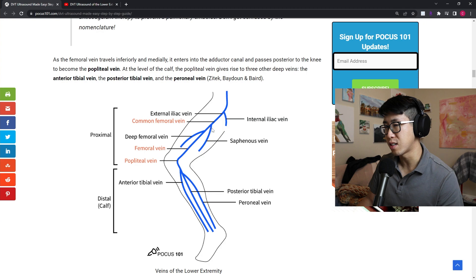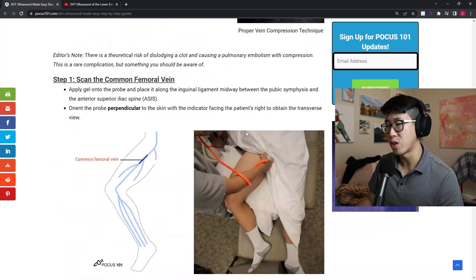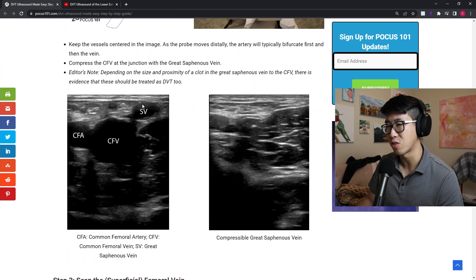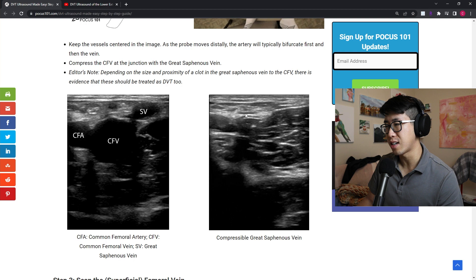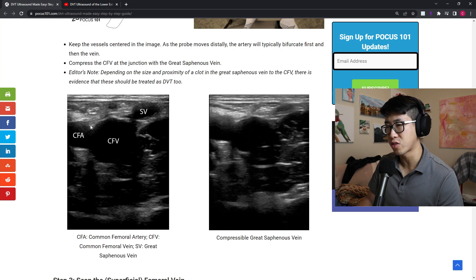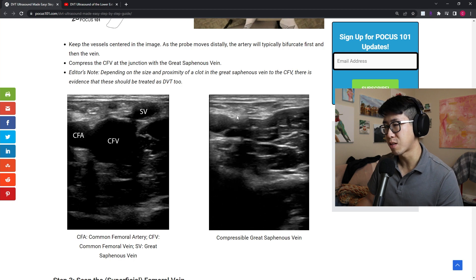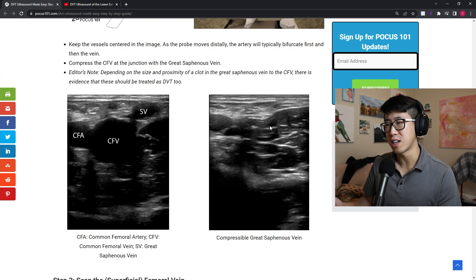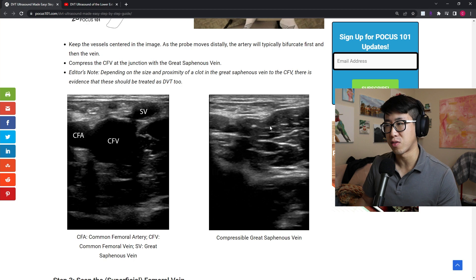For the first point at the common femoral vein and the saphenous vein, you're looking for what's called the Mickey Mouse sign — you have the saphenous vein, the common femoral vein, and the common femoral artery. Once you find this structure, you're going to start compressing so that the artery slightly gets compressed but the veins should be fully compressed. If there's a clot, you may visualize it or you won't have compressibility of the veins.